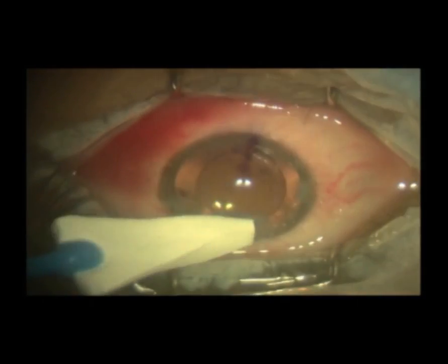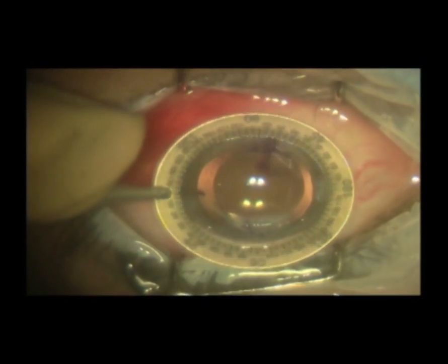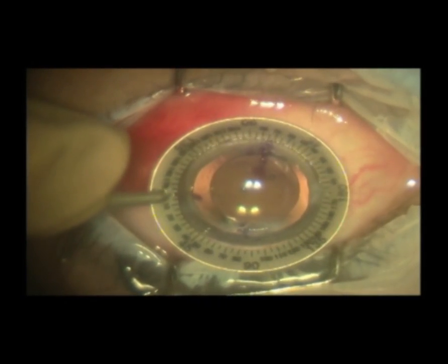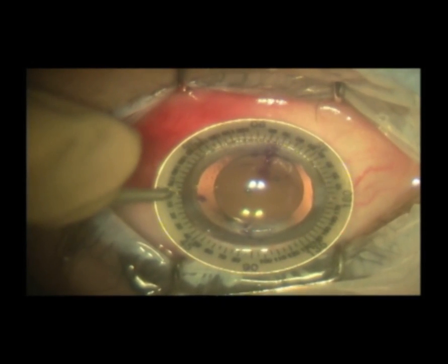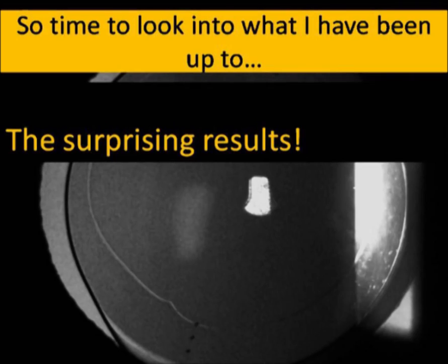Finally, at the end of the surgery, I recheck the axis of placement with the axis marker. First postoperative day, a dilated slit lamp examination to look for misalignment. So, time to look into what I've been up to, the surprising results.